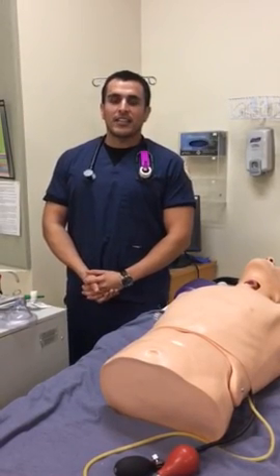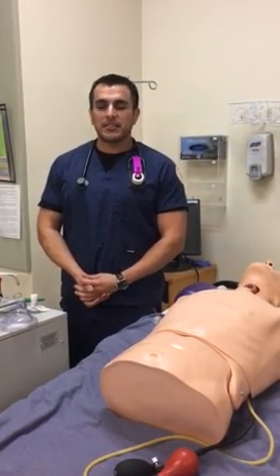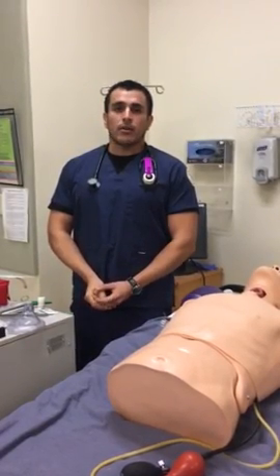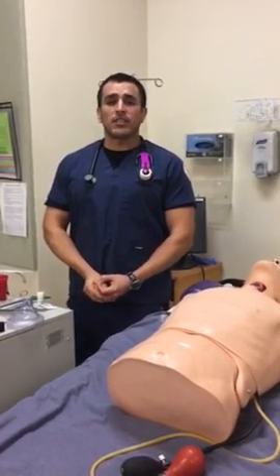Hi, I'm Daniel, and this is going to be the intubation competency. For intubation, the first thing that I would want to do is evaluate the need for intubation.